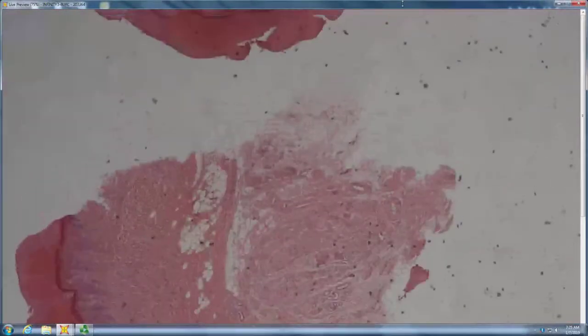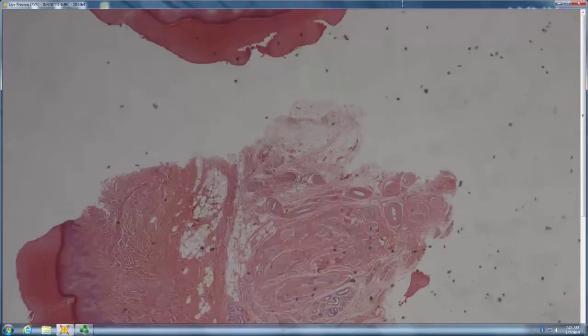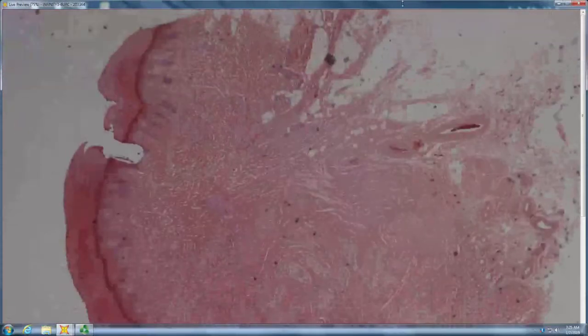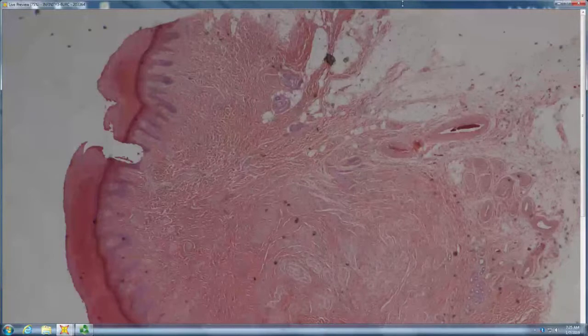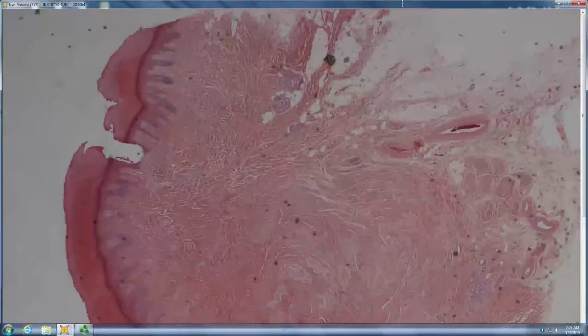Neurothekeoma? Neurothekeomas are either cellular or myxoid, and are pools of mucin with stellate cells. Oh, it's plexiform? Looks kind of like a plexiform neuroma, but in a bump that's distinctly on acral skin. Anyone? Oh, accessory digit.